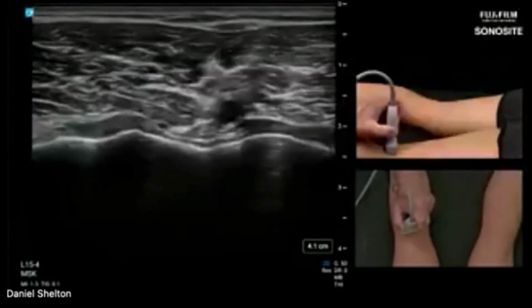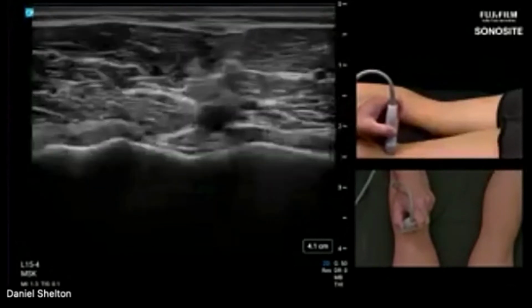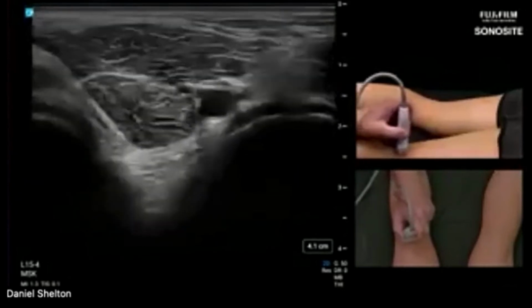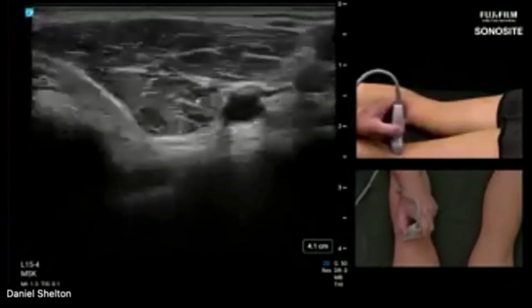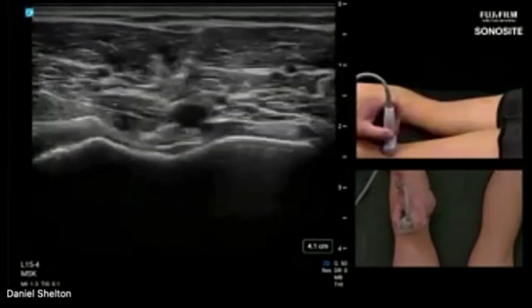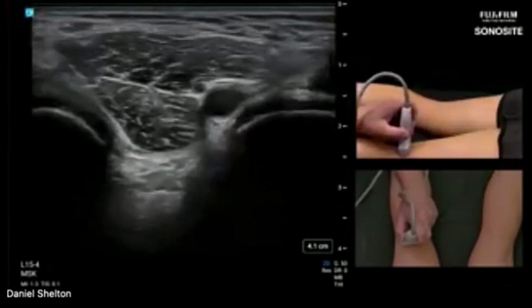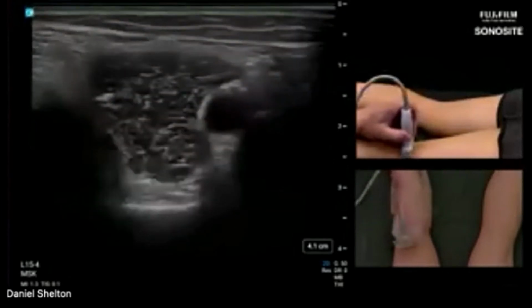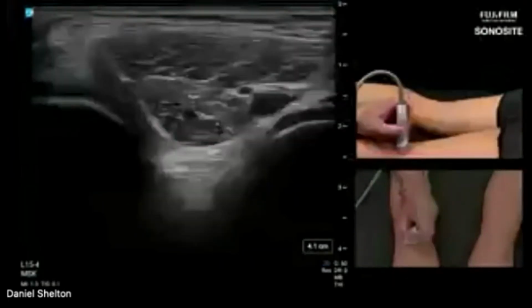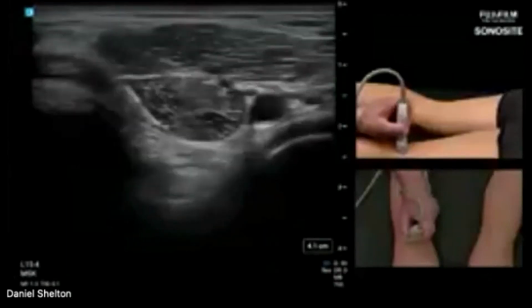Like I said, not all your patients are going to be this size, or image this clearly, depending on the machine you have. So you really must scan your sonographic cortical landmarks before you're confident on what's going on in the back of the knee. So clearly identify the posterior tibia, clearly identify the margins of the femur in each condyle, okay? And then you can see that tunnel between the two, and I can see all the way down into that area where our ACL and PCL anatomy starts to get fun.